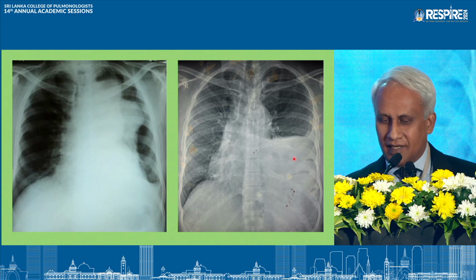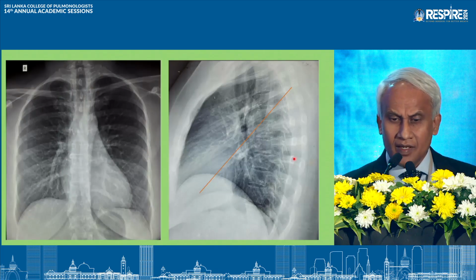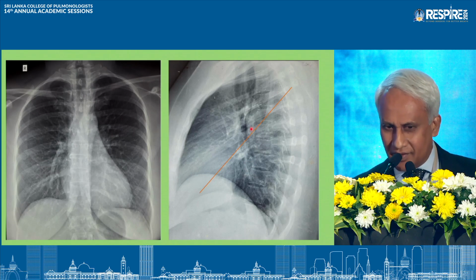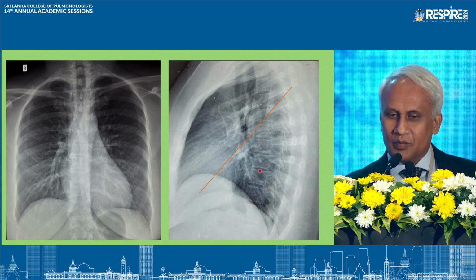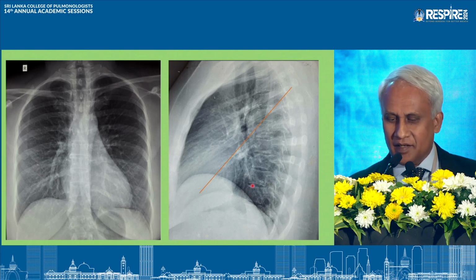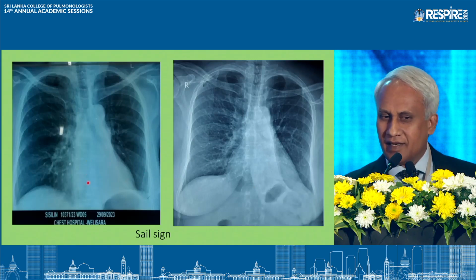So this is actually diaphragmatic hernia. Coming on to the left side, this is the left side. You have left upper lobe and the lower lobe, and see the changes there. If the lower lobe is going to collapse, it will collapse downward and stays behind the heart. So these two pictures show behind the heart opacities.